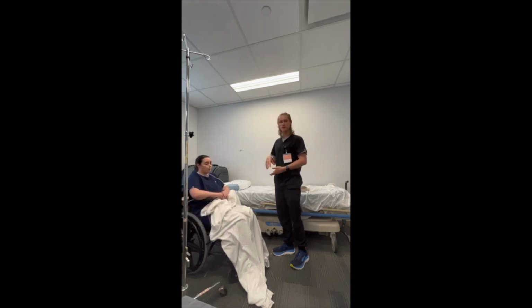We couldn't really demonstrate that here, but when you're walking upstairs, make sure you visualize how much line exists for a patient to walk up. Can we walk up 2 steps and then are we going to turn around? Or are you going to carry everything with you? And if you do, make sure that they're not crossing the legs in front, make sure they're not catching on the railings, and make sure you cue the patient to turn towards the side that you want so that they're not pulling away from the wire.